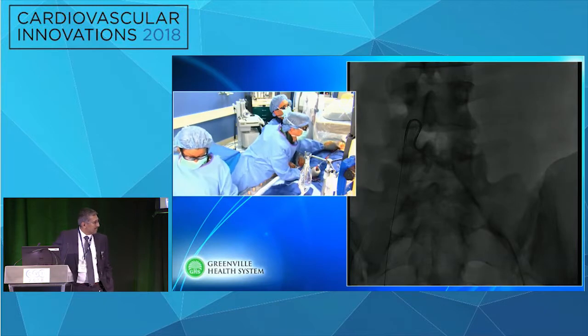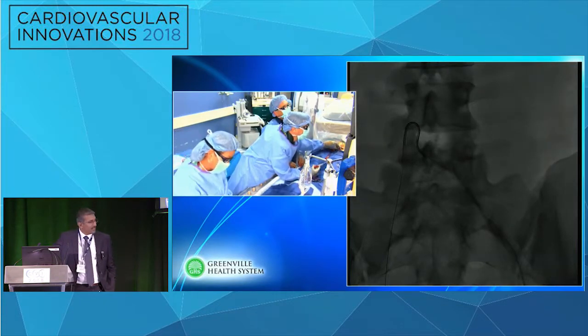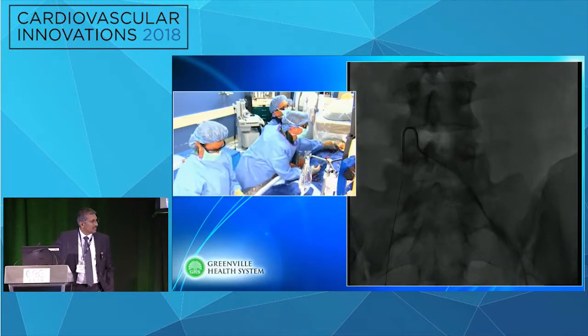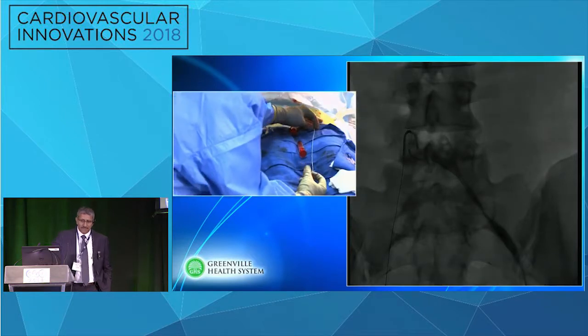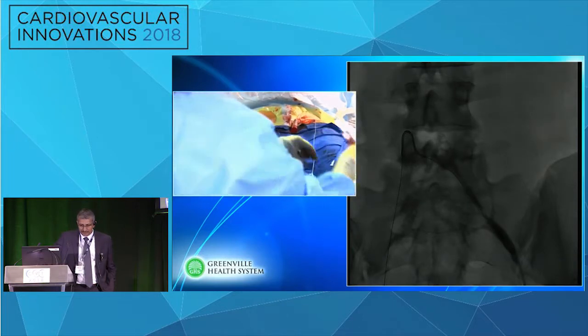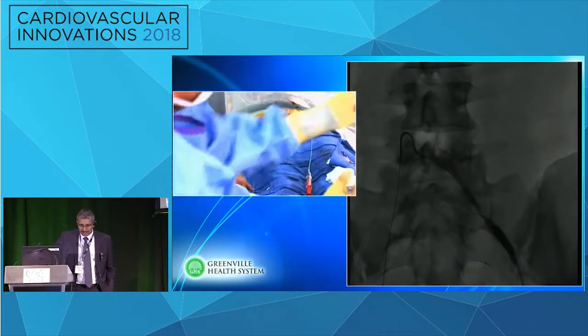Again, the loop backs up the support. Maybe a rim with a shorter, tighter curve. Have a prograde catheter, please. I think you crossed. Beautiful. I think that's close to that other catheter. I think we're very close.